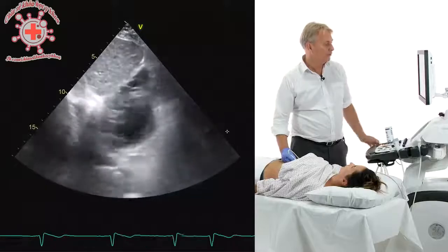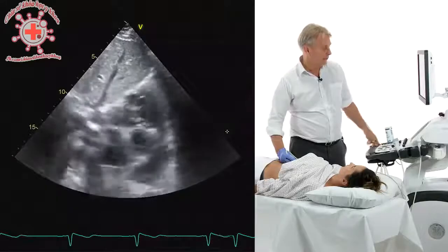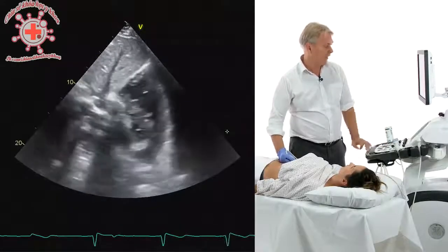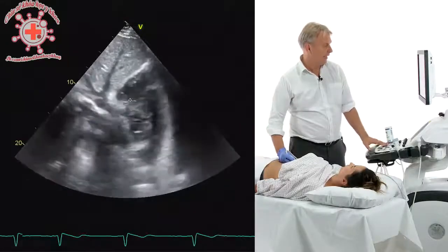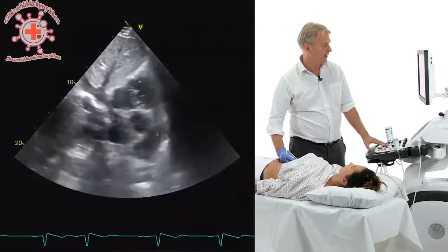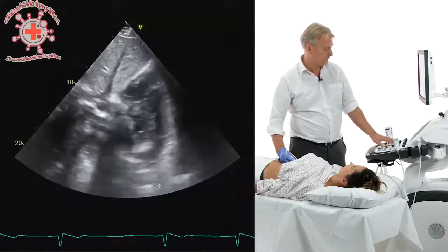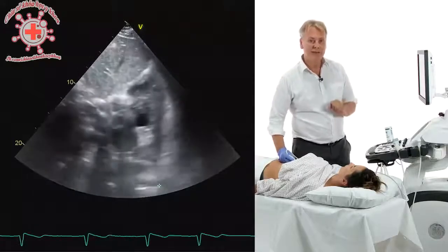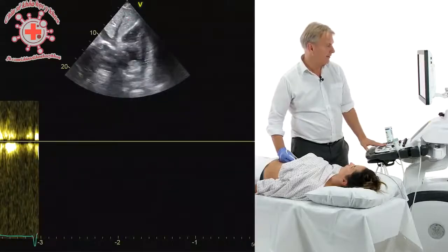In addition, if you rotate or tilt the transducer a little bit more to the right, you will get a view that you also know from the parasternal window. It's a short axis view, again, with the aortic valve here in the center of your image, and the pulmonic artery with the pulmonic valve right down here. This would be the bifurcation, the right and the left pulmonary branch. This, as a matter of fact, is my favorite view if I really want to assess the flow signal across the pulmonic artery. You see how nicely this can be performed?